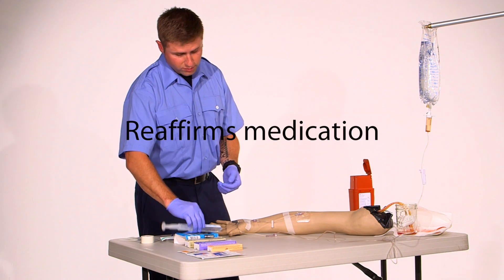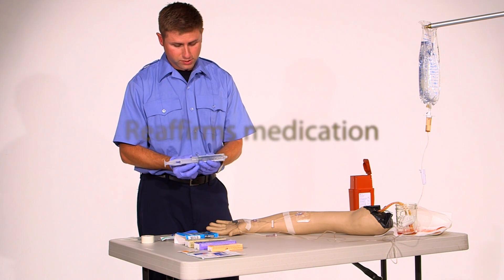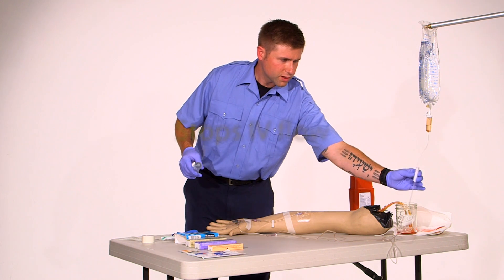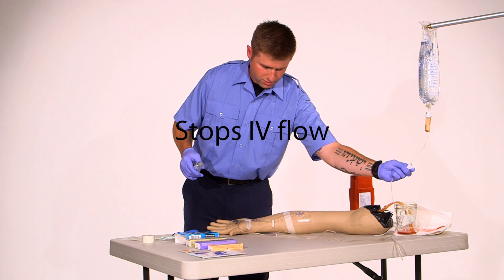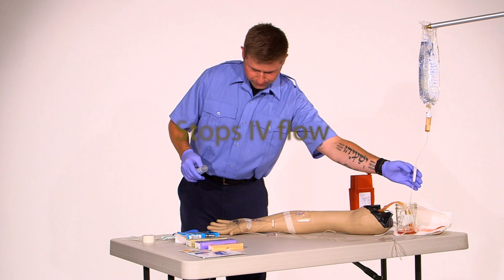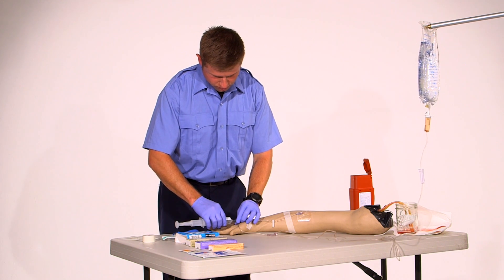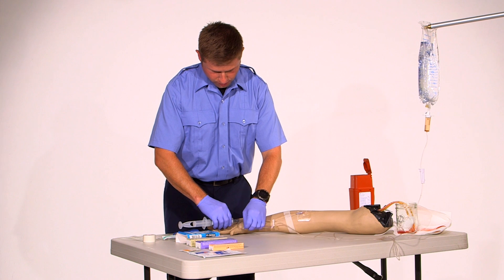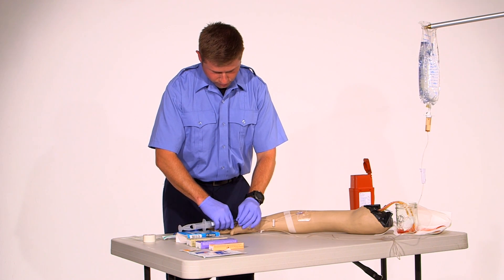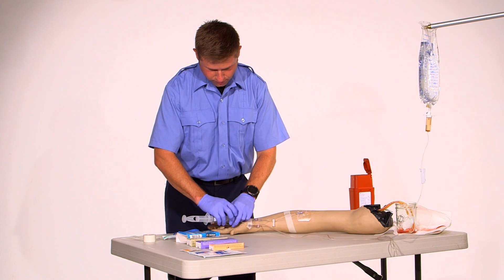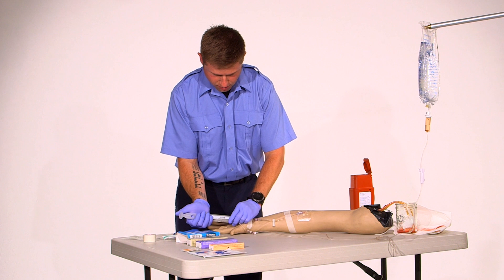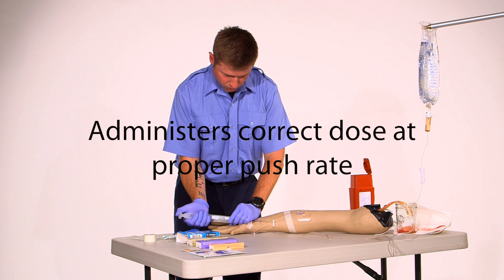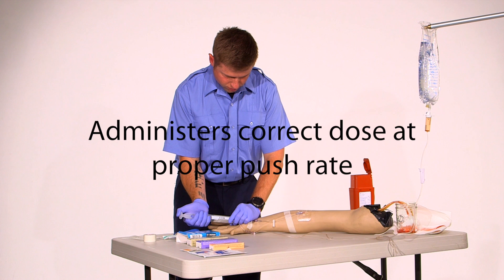Once again I'm going to affirm that this is 50% dextrose and I am going to stop the IV line. I'm going to connect the dextrose to the line. Before I push I'm going to occlude the line so I don't push any up into the saline bag. And at this time I will slowly push the dextrose.